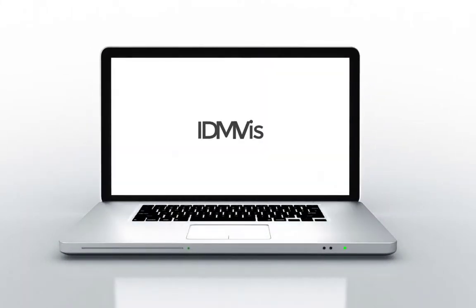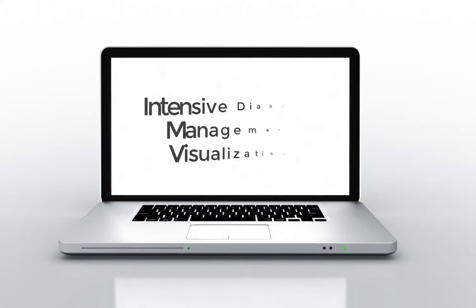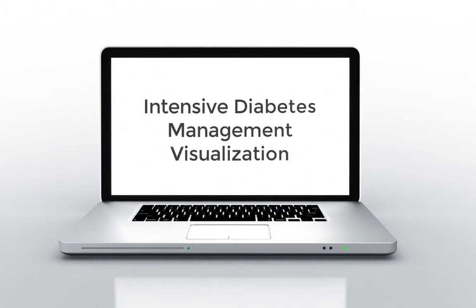This video presents IDMVIZ, Intensive Type 1 Diabetes Management Visualization for Clinicians.